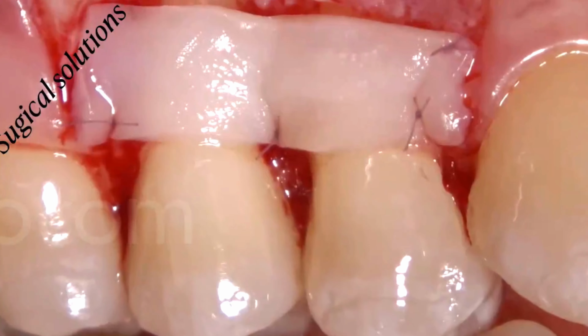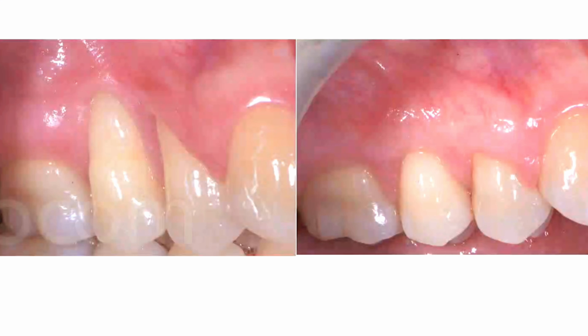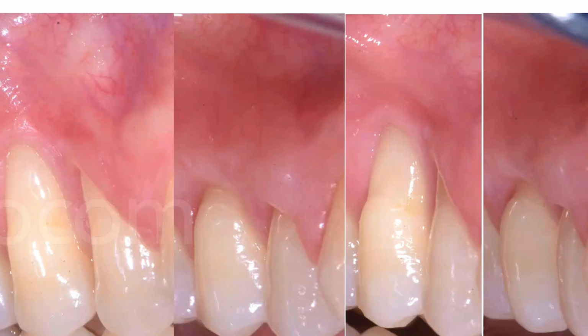But as I told you before, so stabilization of the graft, and this is the healing, which is very good. But if you look carefully, not all the root is completely covered. Here there is about 1 millimeter of remaining gingival recession, and most probably there is 0.5 millimeters. So when you judge this, it's not a complete coverage, but it's not a case where you can try to do something more, you know?